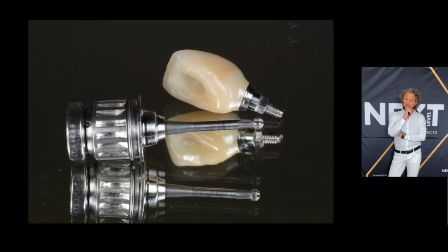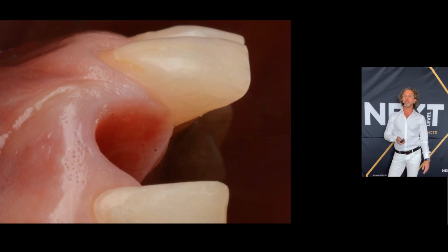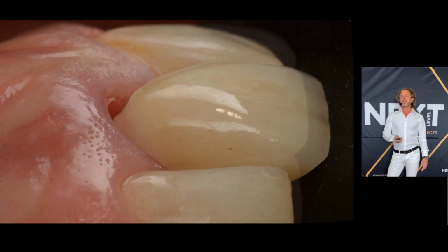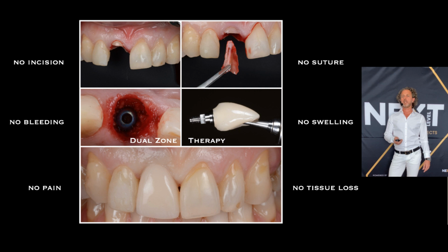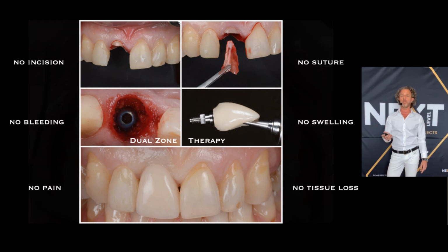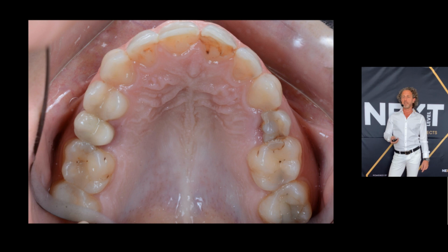And this is the prosthetic solution, which is almost always, 99% or even more, screw retained in my cases. Look at this tissue profile, how amazing it is. The final outcome. And look at this collage: no incision, no suture, no bleeding, no swelling, no pain, no tissue loss at all. This is why I love it.